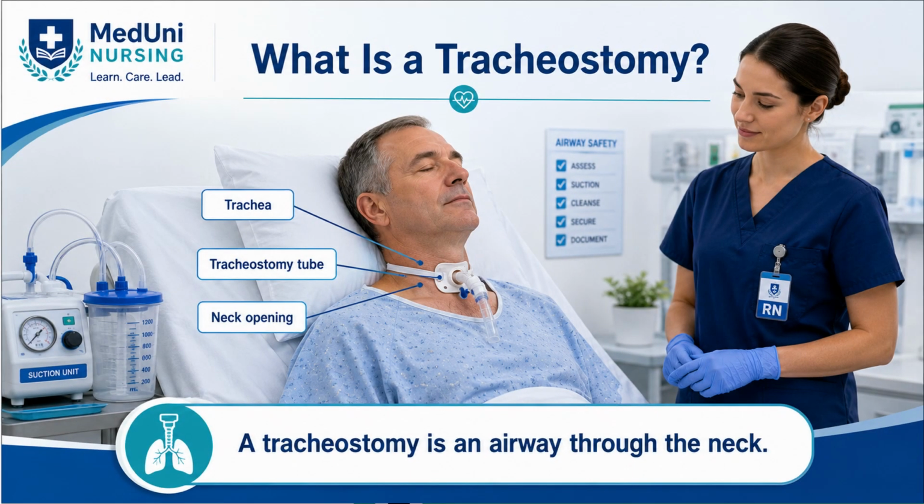A tracheostomy is an airway through the neck, with a tube placed directly into the trachea. It may help the patient breathe, clear secretions, receive oxygen, humidification, suction, or ventilator support. Now pause. Why is tracheostomy care high risk? Because this is the patient's airway. A blocked or displaced tube can quickly cause respiratory distress and hypoxia. So your first thought should always be airway first, act fast, escalate early.